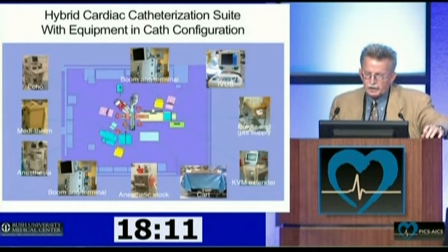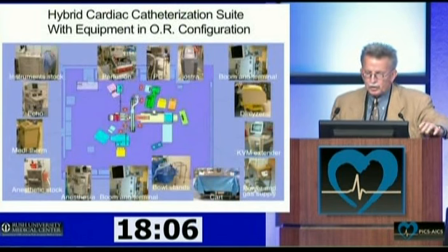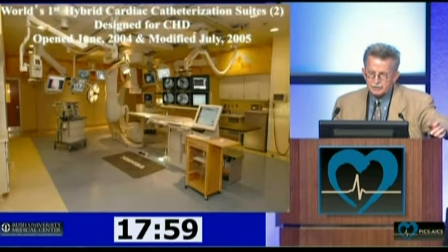You can see the little drawings. What would it be if we had this cath lab equipped in a cath configuration? What would all the equipment be if we had the cath lab in an OR configuration, so we could figure out how to design the equipment? We ended up with something like this.